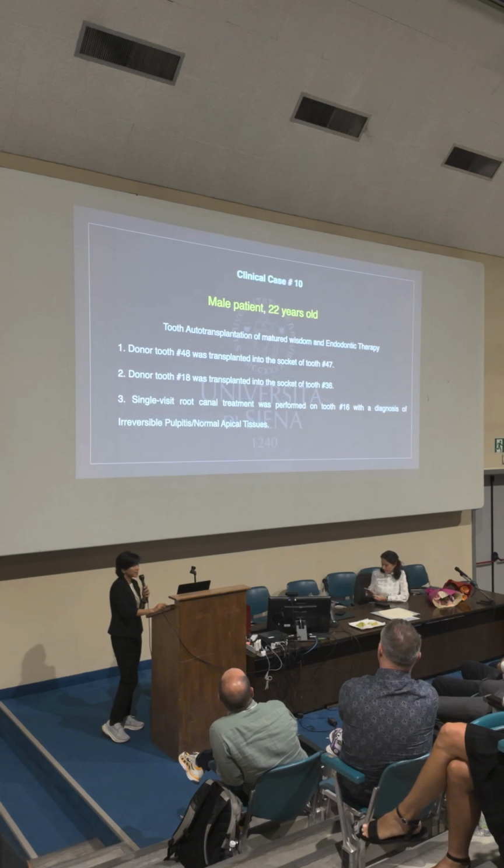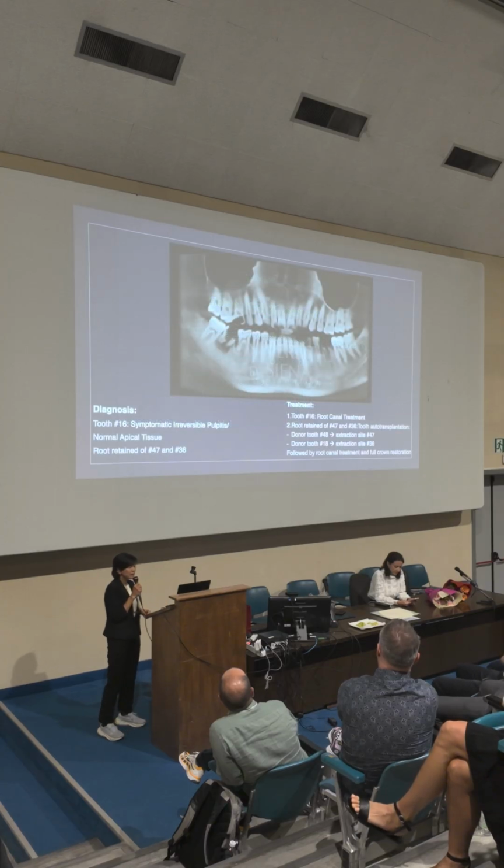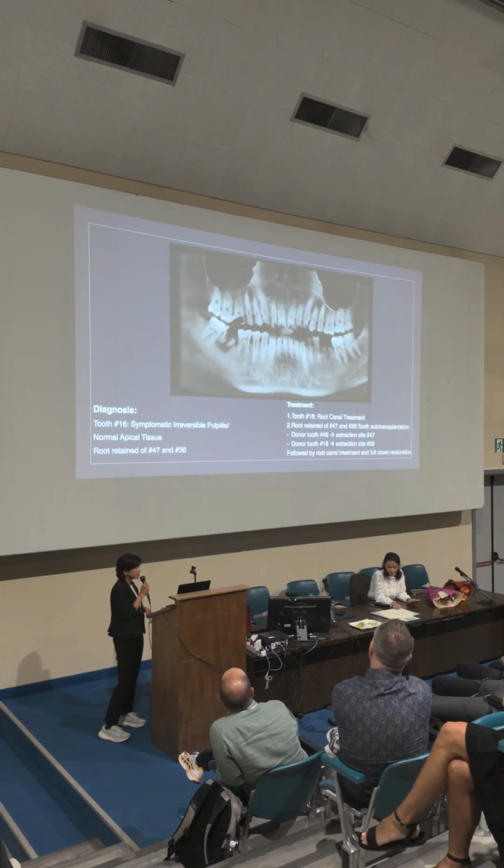In my second case, a 22-year-old male patient came to see me because he cannot afford the dental implant. And you can see the CBCT is that.